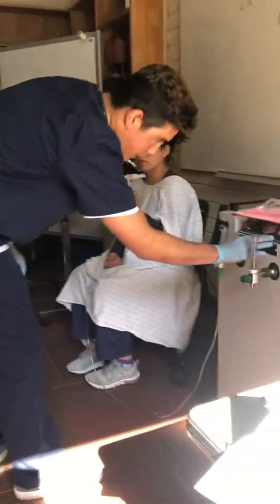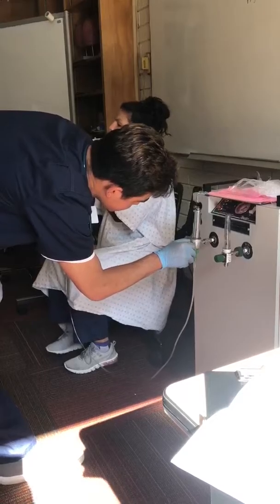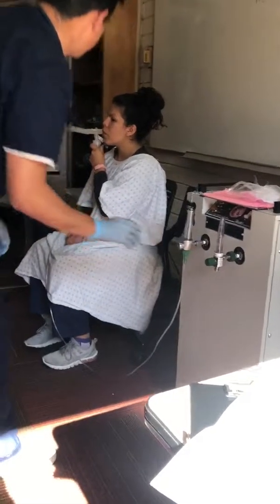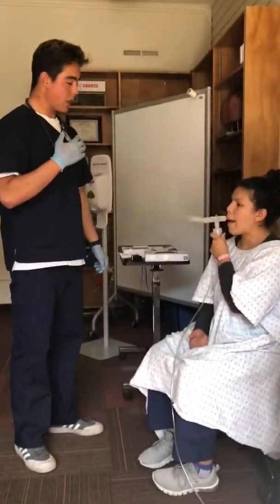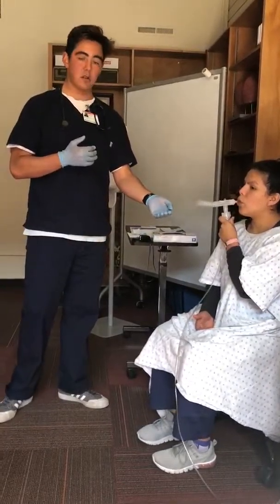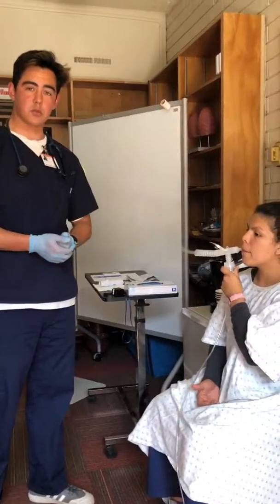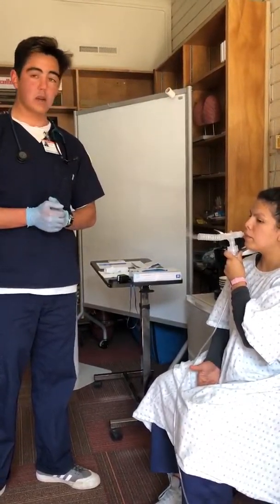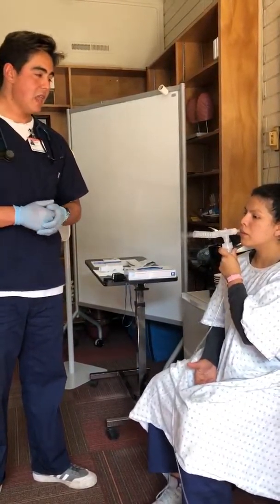I'm going to turn this on. 6 liters a minute. Okay. So you're going to place your teeth over that, your tongue underneath, and seal your lips around it. We're checking for the presence of aerosol gas so that to determine it's working. Coach the patient through nice even breaths. Periodically, we're going to want to do a nice deep breath for total lung capacity.